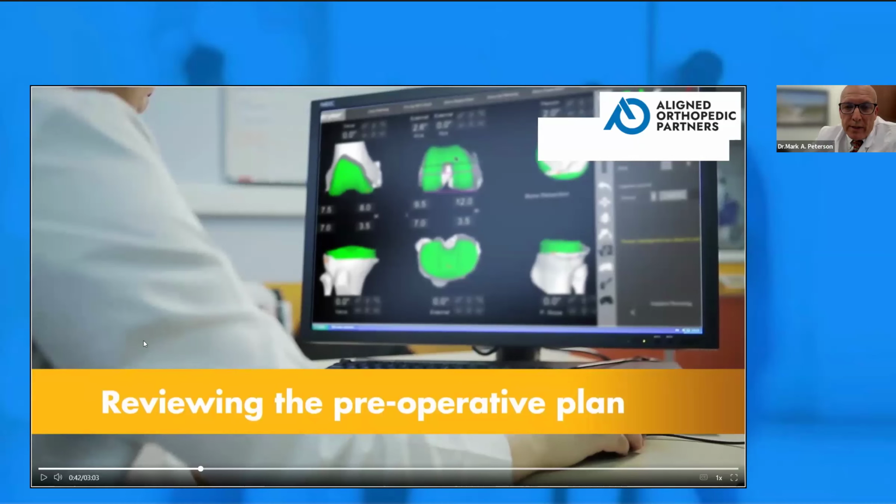So again, if you look at this CT scan, these are all images that are done prior to going into the operating room. So we know the exact size of the implant and the location where we're going to put it. Intraoperatively, we will adjust the rotation of it and maybe what's called a varus or valgus angle to the implant, because we can make fine adjustments to fit each individual patient.